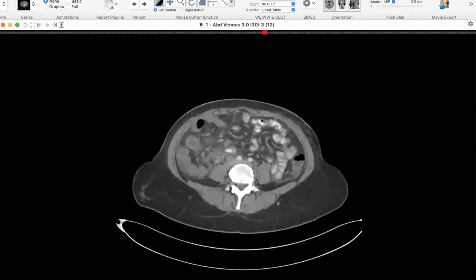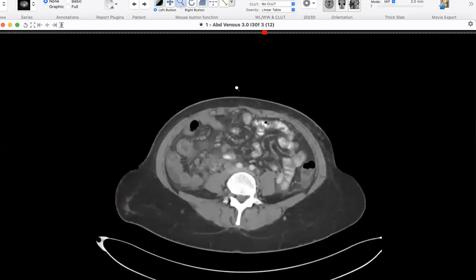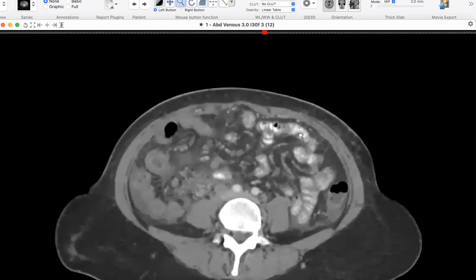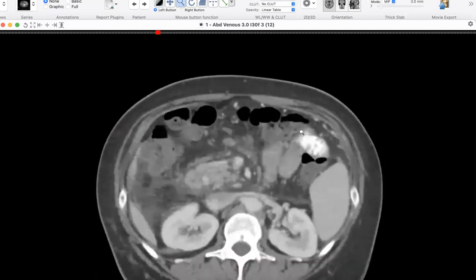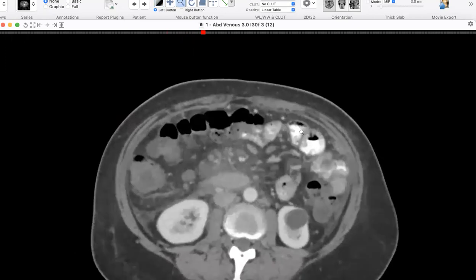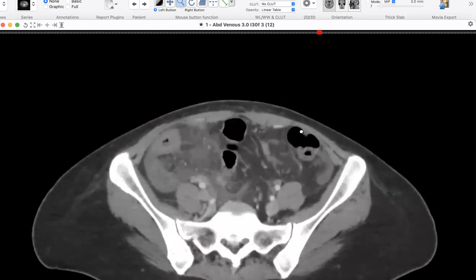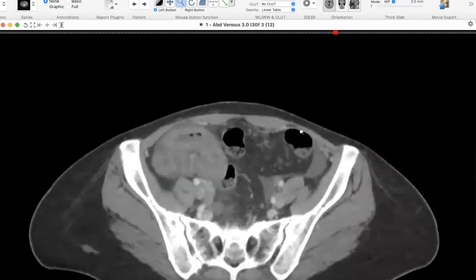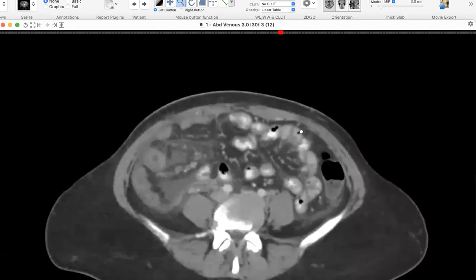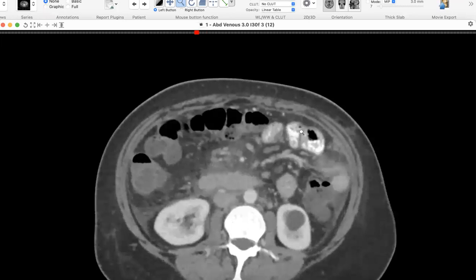Anything else? If there is a primary, it may be... No primary. Congested mesenteric vessels. No, I can't remember anything else. Just Crohn's, lymphoma, ulcerative colitis. How would you manage this patient?